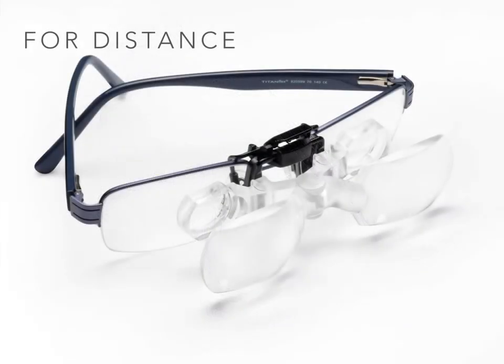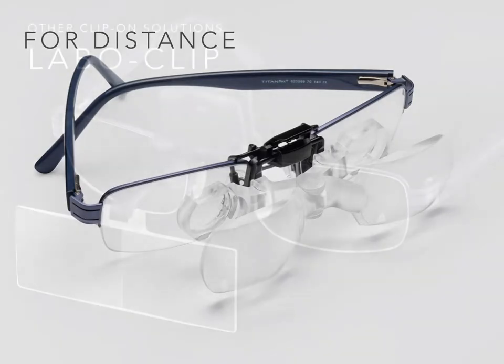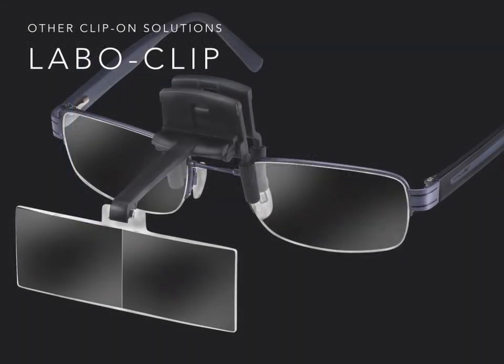A similar system is also available for distance, called the Max TV clip. The same design, magnification, and weight principles have been used to develop a similar product clipped over the user's spectacles to assist with television viewing. Other clip-on solutions also exist, such as a simple double lens attached to the end of a stem. The mounting clips the magnifier over the spectacles, and the stem is flexible so that the lenses may be adjusted up and down by the patient to assist maximum viewing comfort.